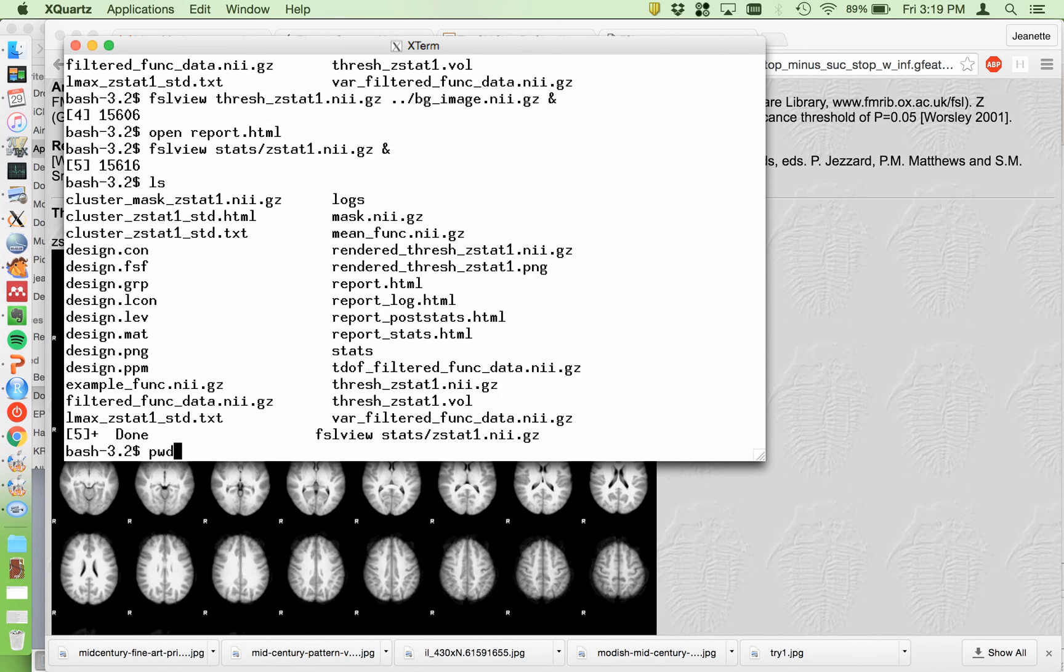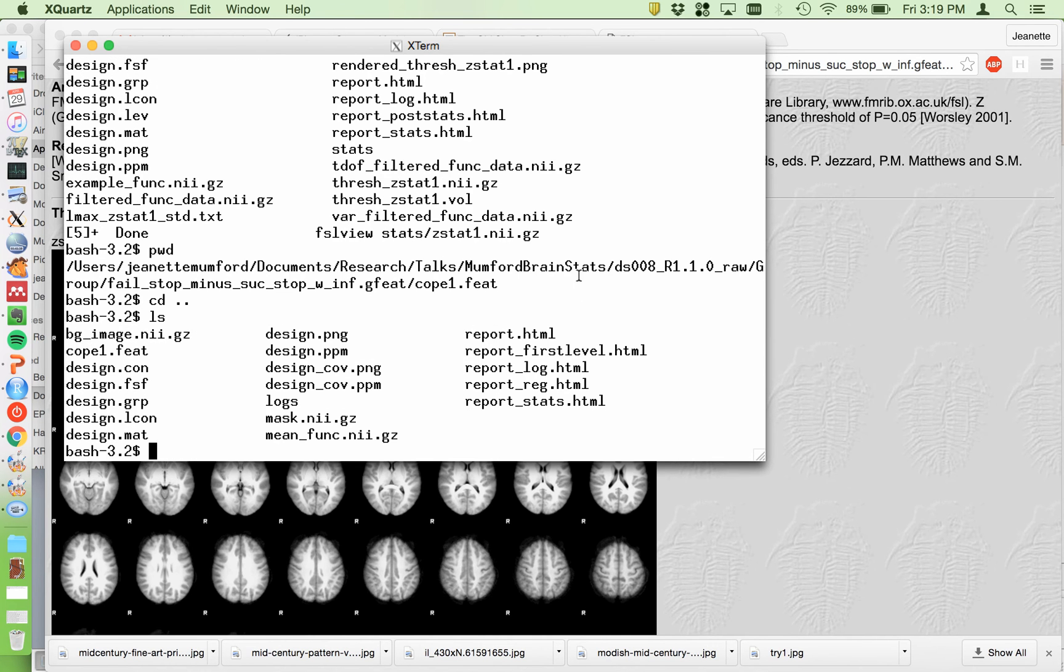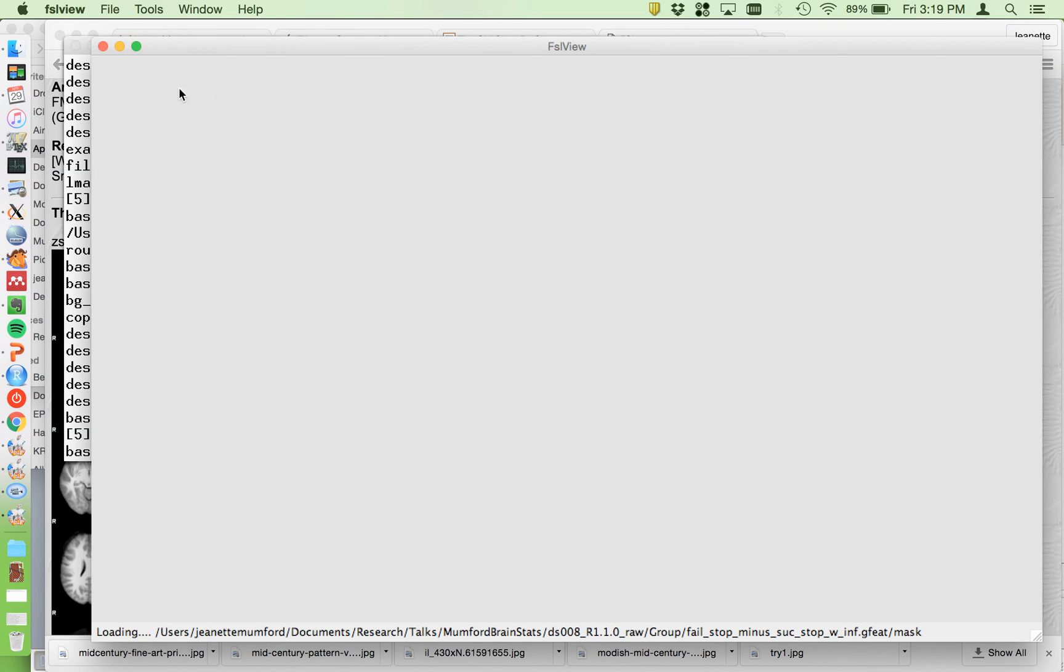Alright, the main directory looks like this, like all the other ones, and your mask file is here. So just do a quick look to make sure nothing outrageous is missing.